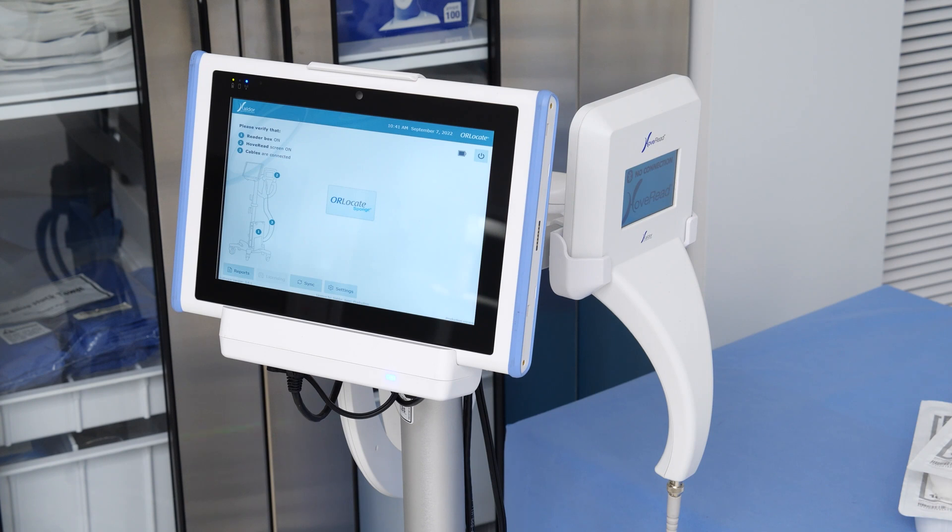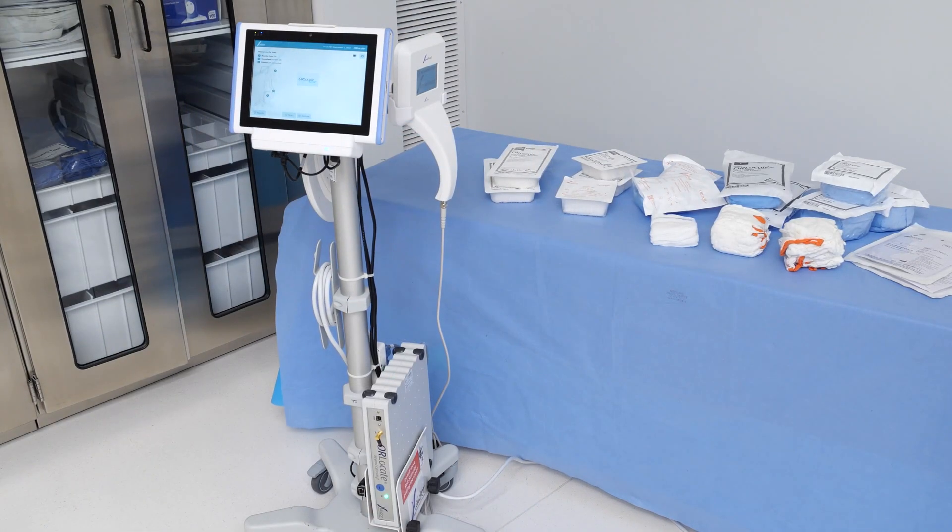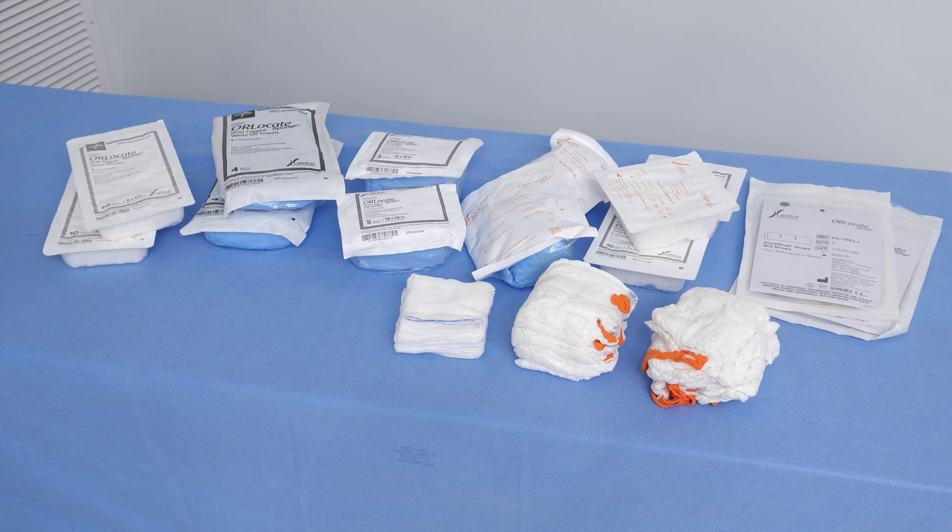The Steris OR Locate solution is indicated for use as an adjunct technology for recording, tracking, and counting RFID-tagged surgical sponges, towels, and other tagged items used during surgical procedures.